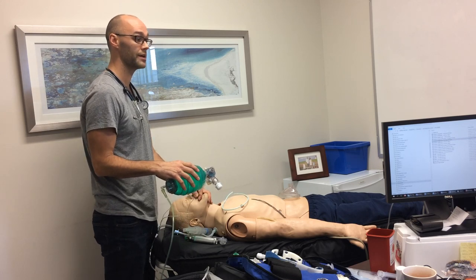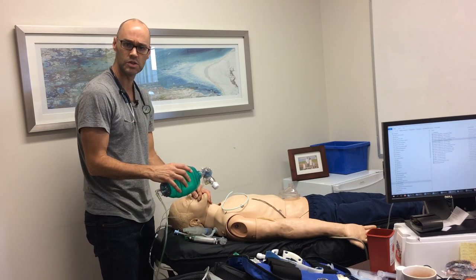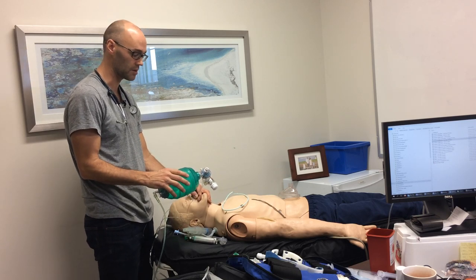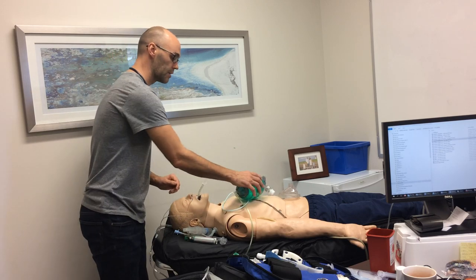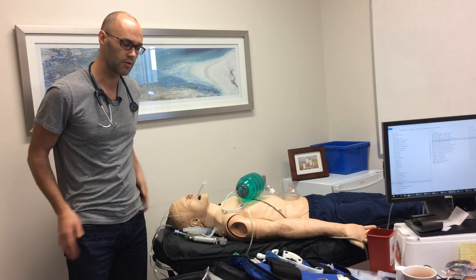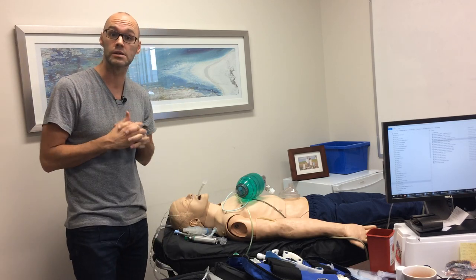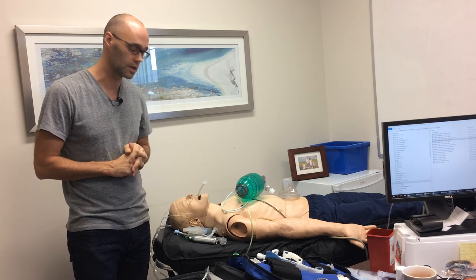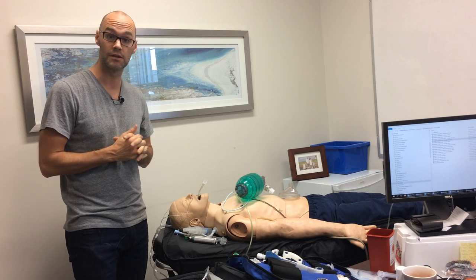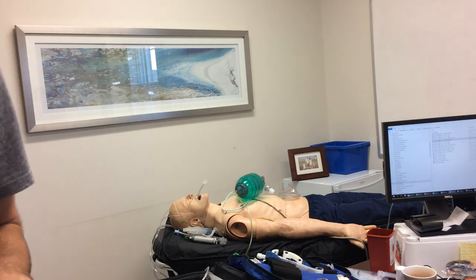Now is a great time to recheck your vital signs, see that your blood pressure is still stable, see what your SpO2 is, and see what your CO2 is at present, and make sure to set a good ventilatory rate — not to hyperventilate the patient. The things we're concerned about post-intubation: monitor sedation, watch for heart rate, and watch SpO2. Remember, with the oxygenation that we've provided, sats could remain up for a long time if we're actually not in the trachea. So be aware of that if you have desaturations in the first minutes post-intubation — you may have never been in the trachea and thought that you were. So there's a quick demonstration of intubation using RSI.